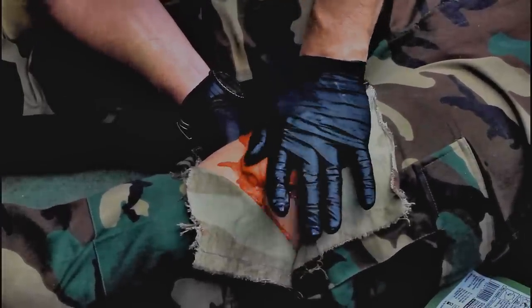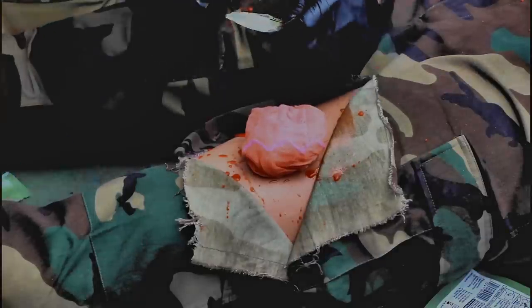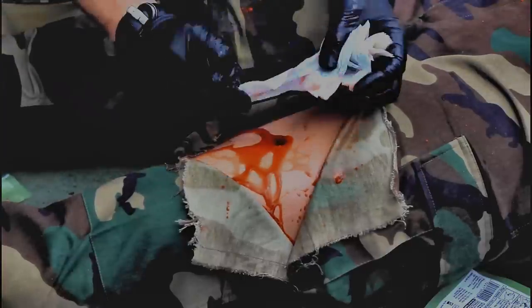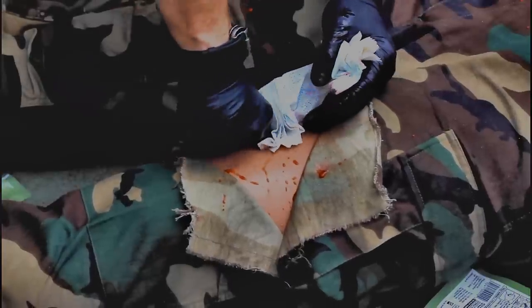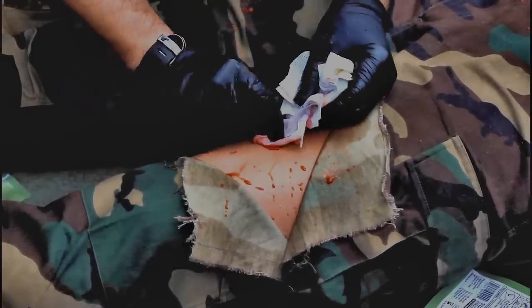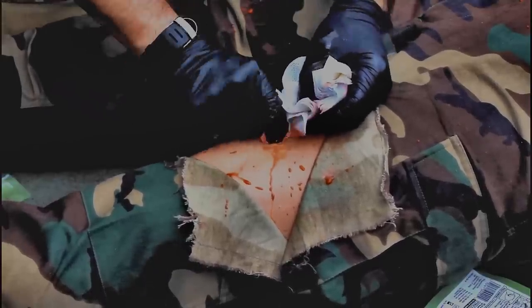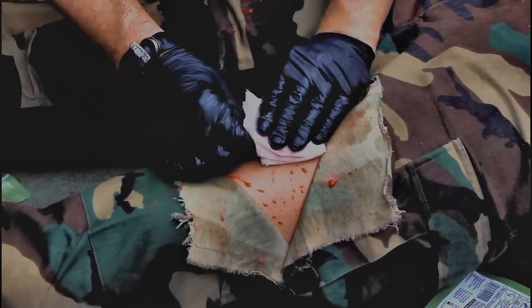In rare instances, active bleeding may continue even after your initial application of combat gauze. The probable cause of this is failure to place the hemostatic agent into contact with the source of bleeding. In the event that prior attempts at stopping bleeding were ineffective due to improper product placement or other factors beyond the caregiver's control, any combat gauze or standard gauze in the wound should be removed. Excess pooled blood should be swept away, the point of bleeding should be visualized if possible, and a fresh combat gauze should be packed into the wound consistent with the product instructions.